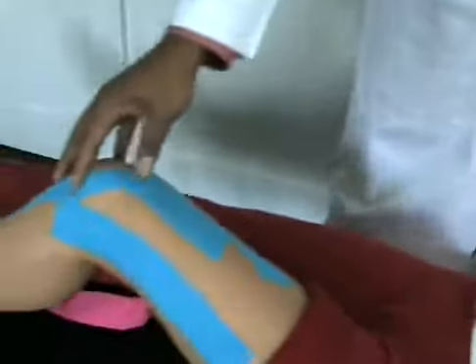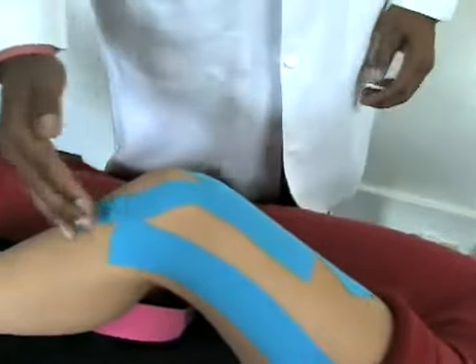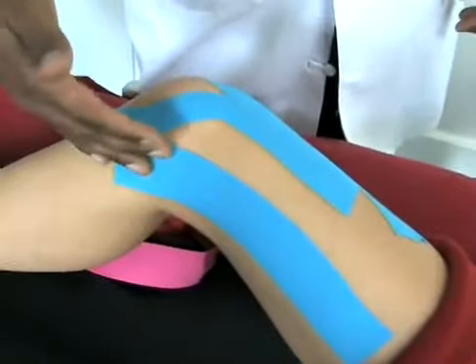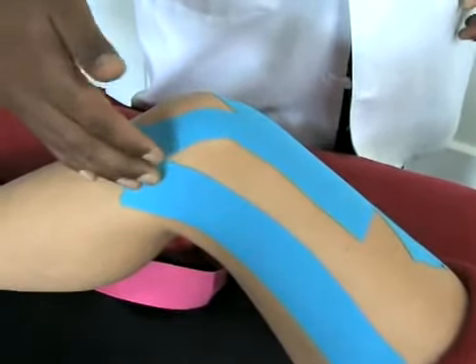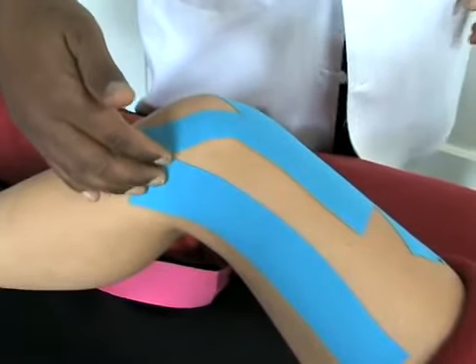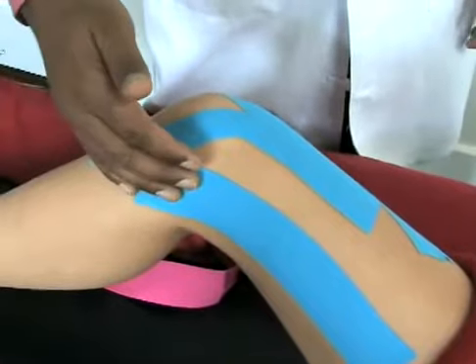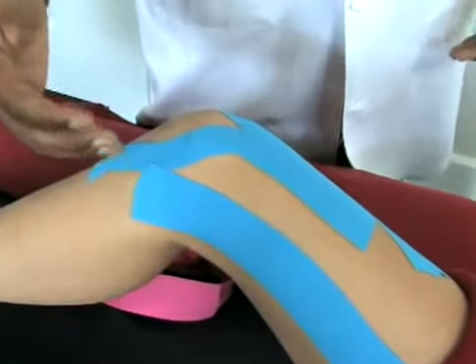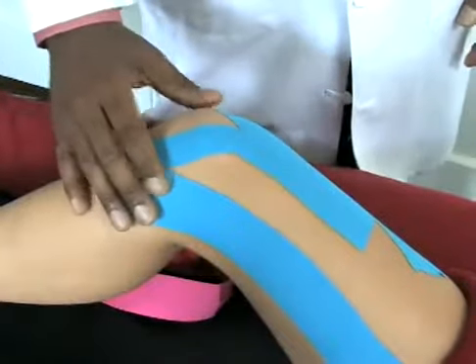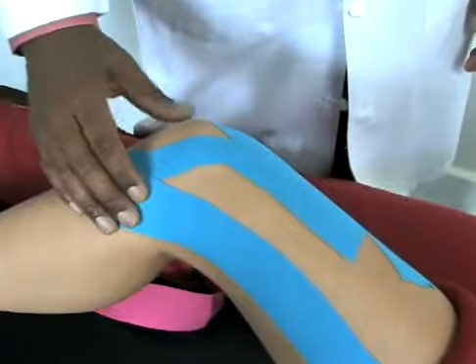We also have, perhaps, a knee that's been either twisted or we may have IT band syndrome. IT band syndrome is iliotibial band syndrome, fairly common with runners, especially when they are training for long distances, and there may be a foot or hip problem that may cause this. This helps with decreasing the pain and inflammation.